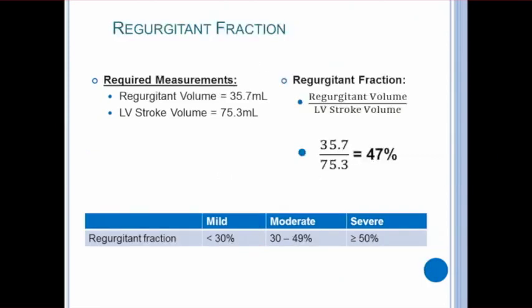Once you've calculated the regurgitant volume, calculating the regurgitant fraction is fairly simple. We only need the regurgitant volume, which we just calculated, and that will be divided by the LV stroke volume. Here we can get a regurgitant fraction of 47%, again consistent with moderate regurgitation.